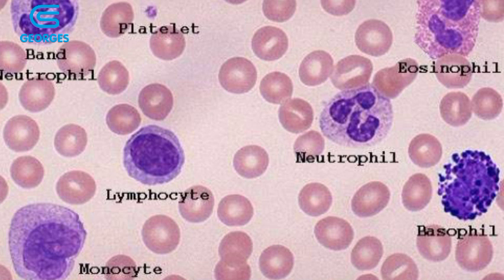So when we are using the automated machines, it is not able to tell us that, hey, there are malaria parasites in this blood sample, because it will only count the blood components. But when we are using manual differentials like the PBF, peripheral blood smear, we are able to see abnormalities and disorders such as maybe infections in the blood, like in case of parasitemia.